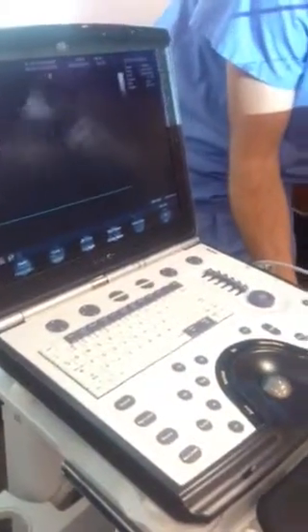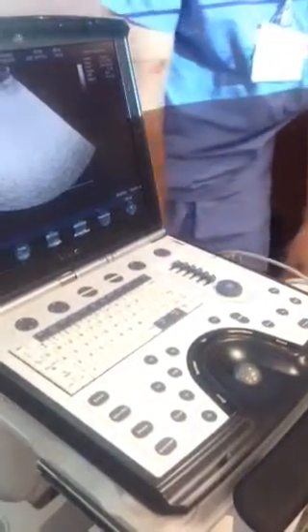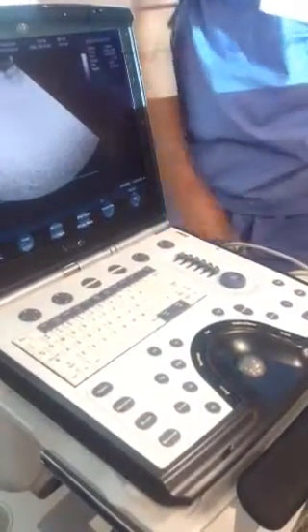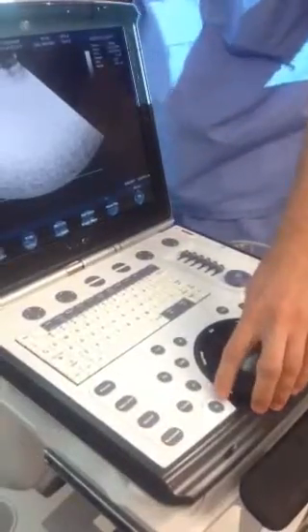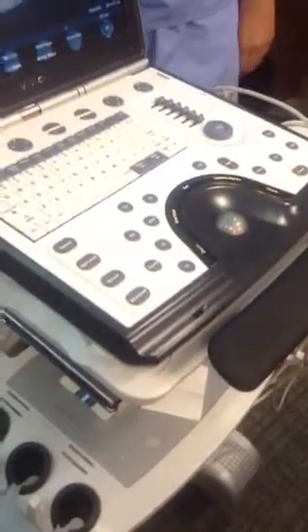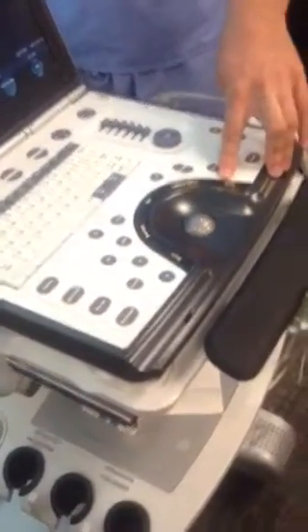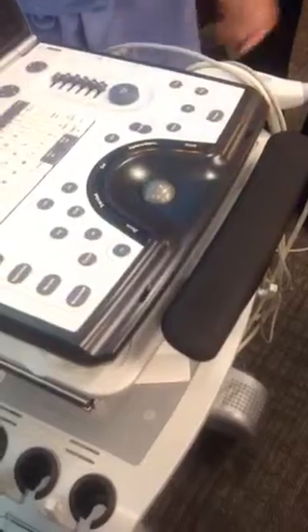When you put a little gel on, you can start imaging. It comes up in 2D mode. You know your active mode here because this light right here around here is highlighted. From here you need to know how to capture. So all the machines are a little bit different. This one's really easy. There's a store button right here. And if you want to hit store, somebody can hit store.